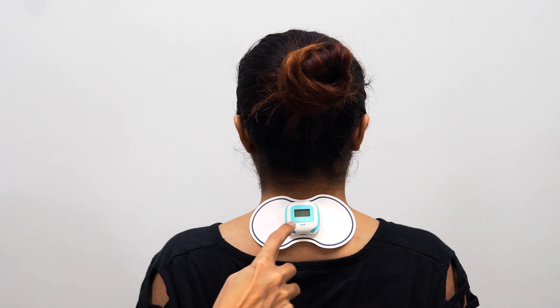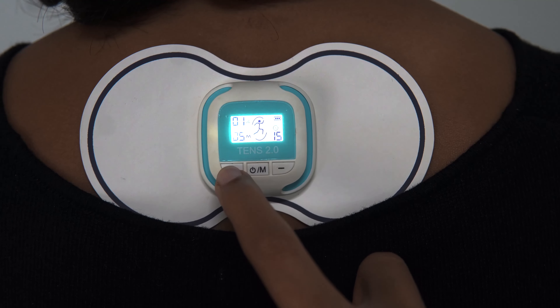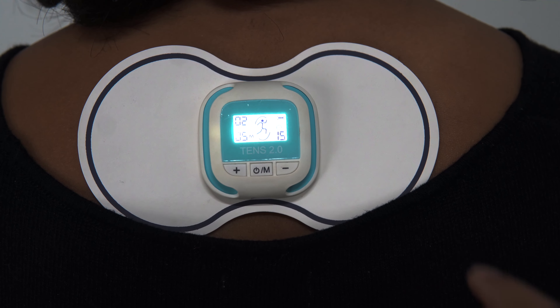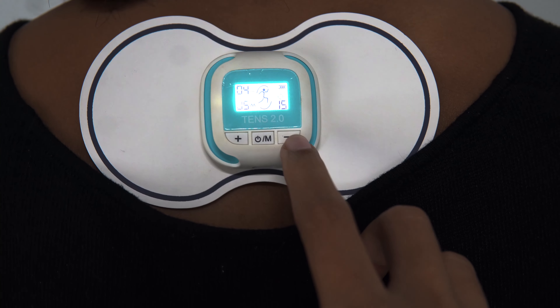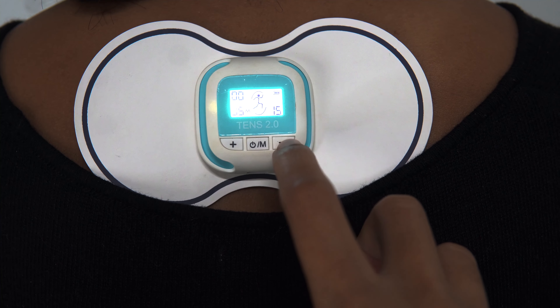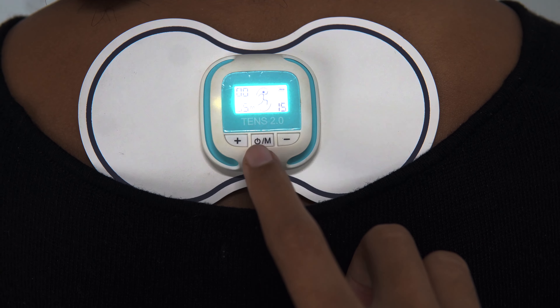As you can see, I have applied it here on the neck. There is a power button to switch on the device, and after that you can press the same button to change the modes. You can then increase or decrease the intensity by pressing the plus and minus buttons on the sides.